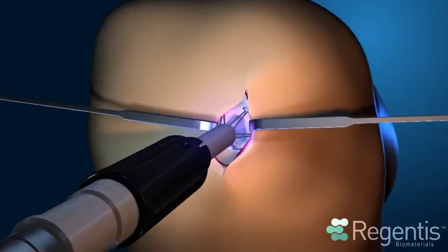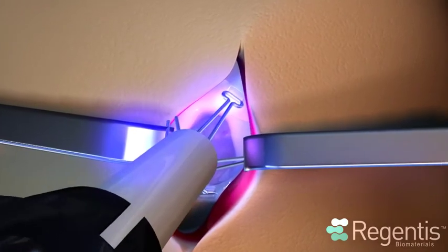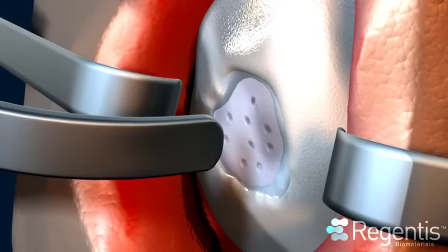Next, the external light source is activated. The hydrogel is cured for 90 seconds into a soft elastomeric implant.